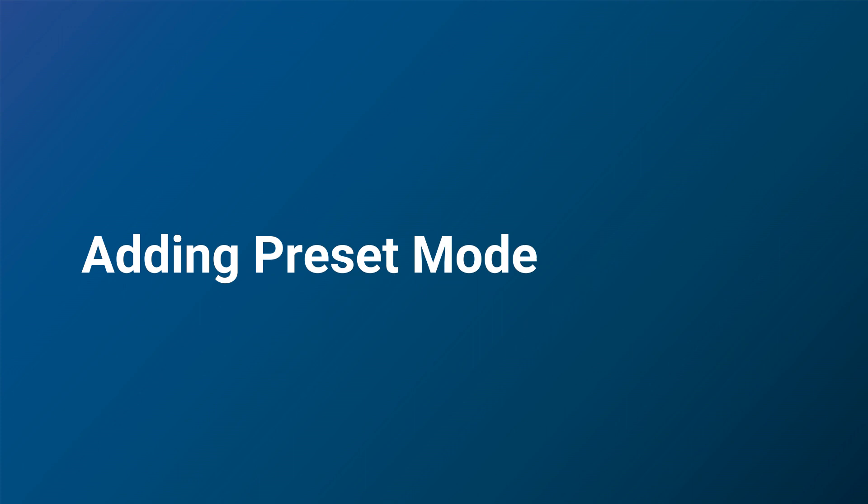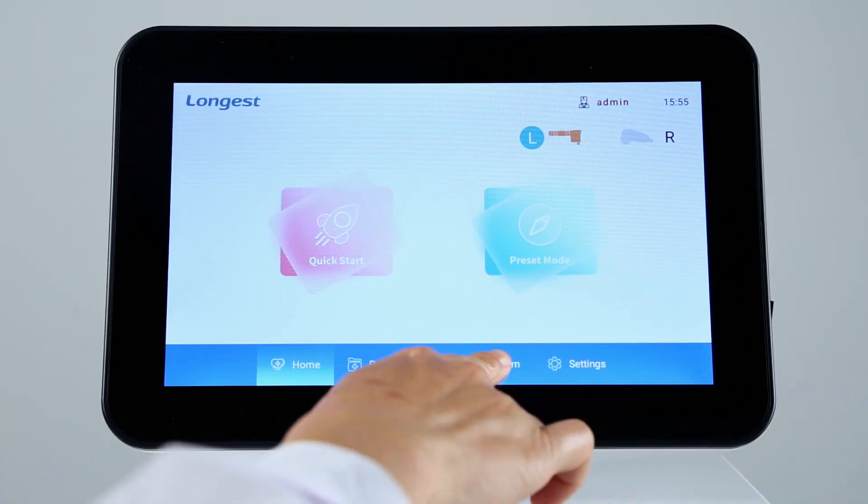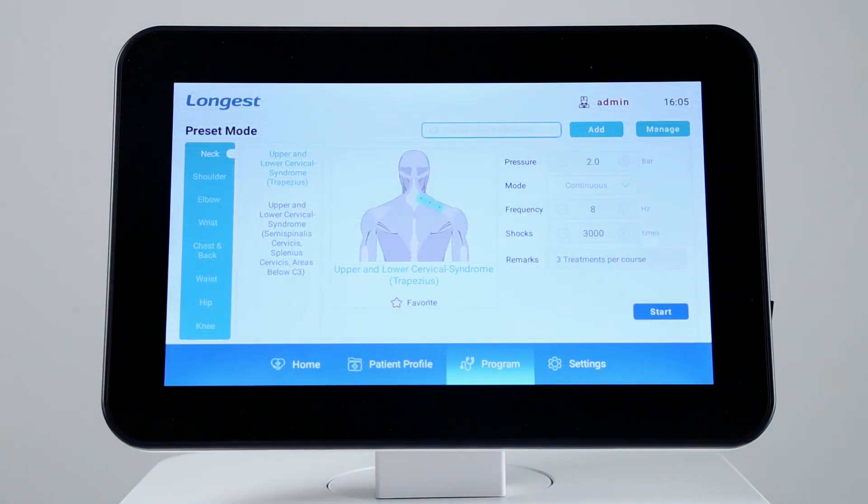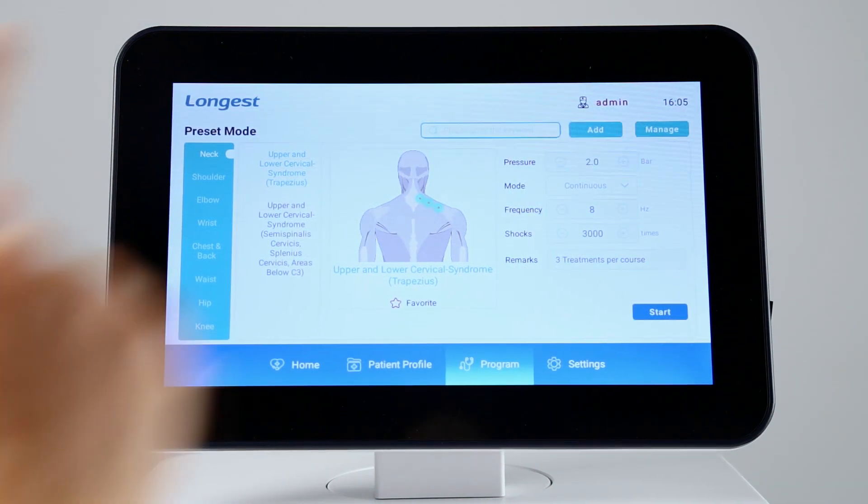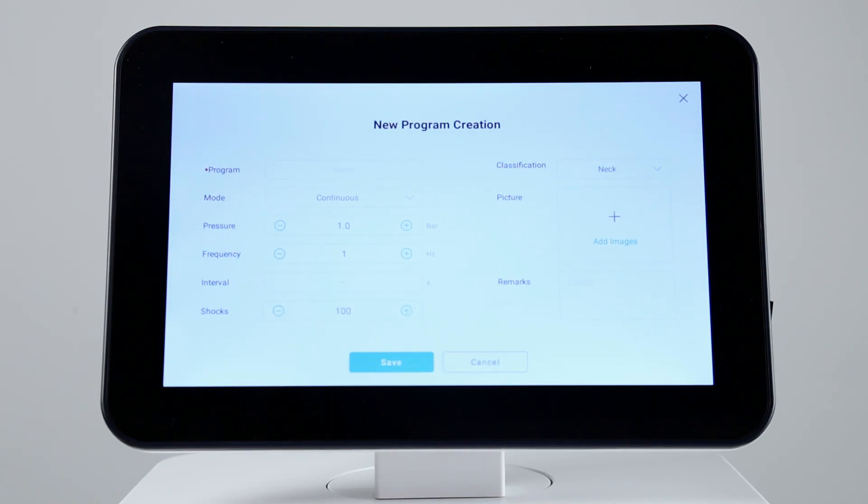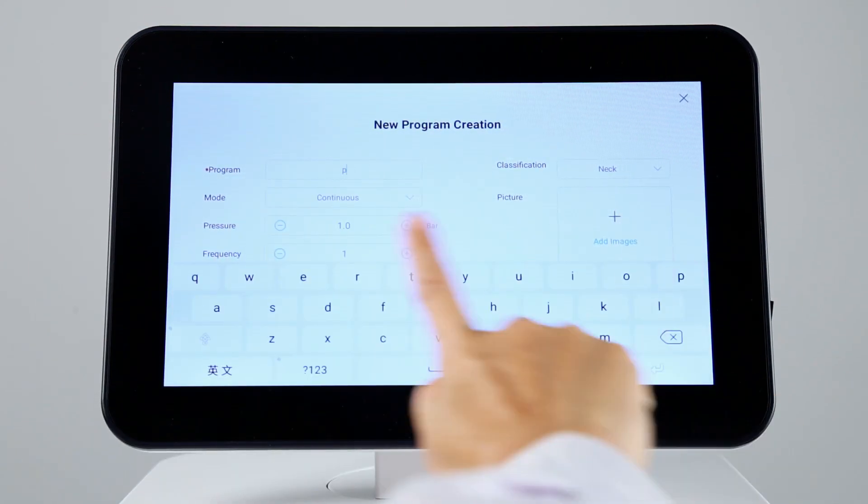You can add your frequently used protocol to the preset protocol library. Click program to enter the protocol library, in which you can find an add button. Click it, then you can add a protocol into the library.